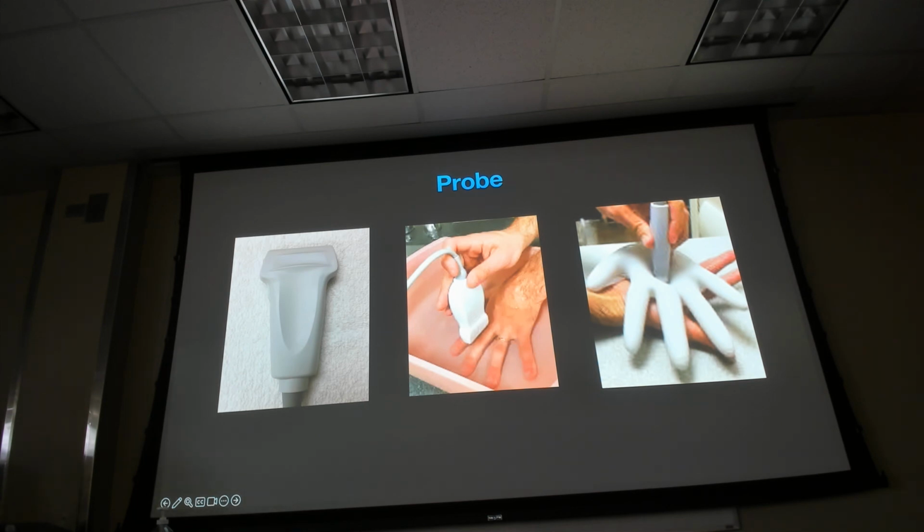It was a few classes ago, one of the females in the class was playing volleyball or whatever, and hurt her finger, or no, I think it was her wrist. She had an x-ray that read as normal, and she kept saying, man, something's wrong with my wrist. Finally we got to block 5, which is typically at the end of EMED, not in the middle. We did an ultrasound there, and you could see a break, really obvious. It was missed on x-ray. She ended up having to get in with a hand surgeon, but it had been broken for about 6 weeks. So we use it a lot for that.